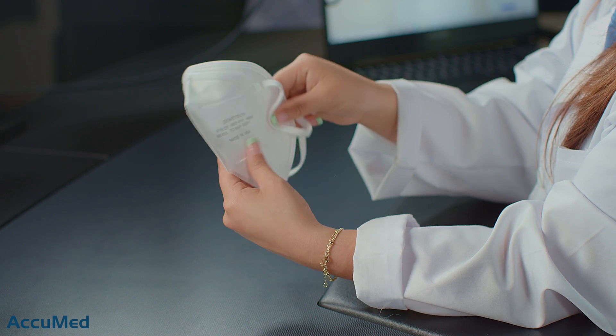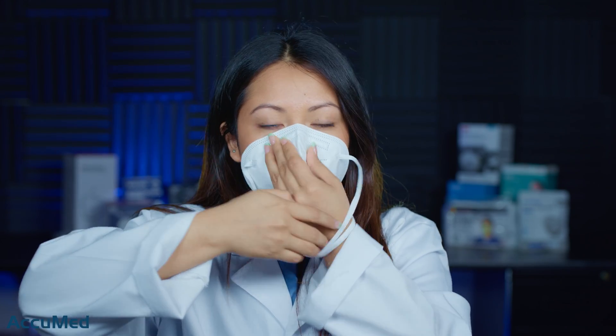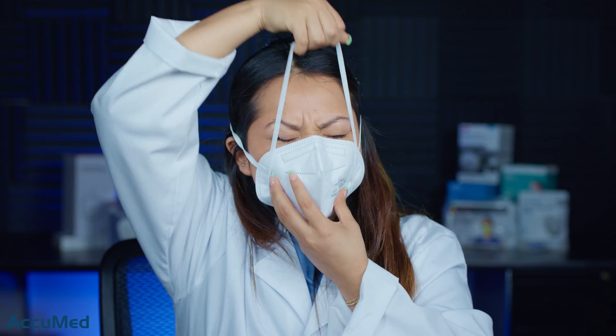That one came off pretty easily, so let me go ahead and get another one and try it on. I'm going to place it here. Now I am adjusting the nose wire to get a better seal. There is quite a bit of collapse.